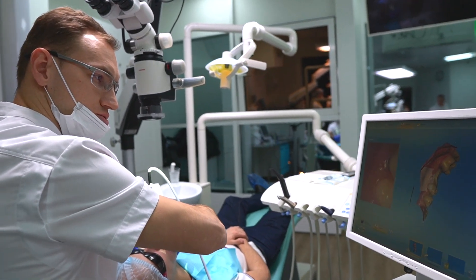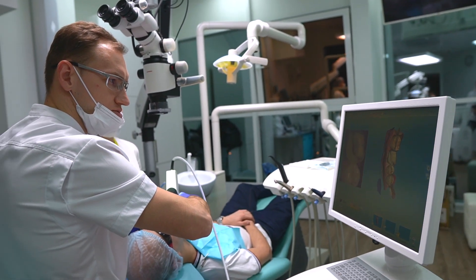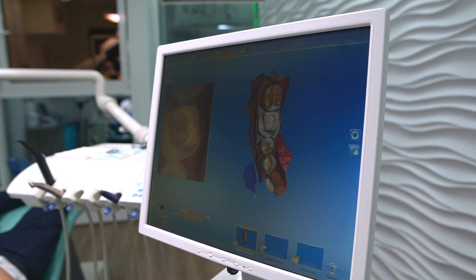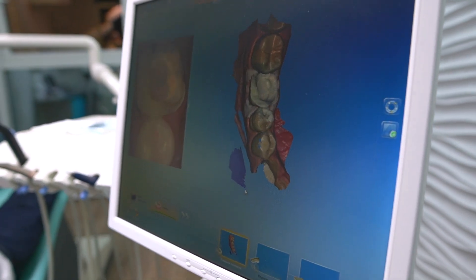Now I'm scanning the lower jaw, our tooth number 4.6. Here there will be a CAD CAM crown. As you can see, it will be kind of overlay — not like a classic crown.